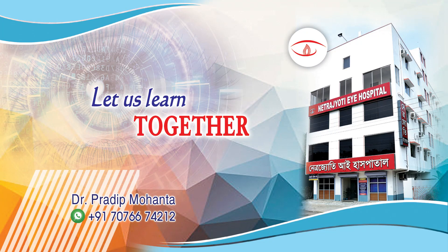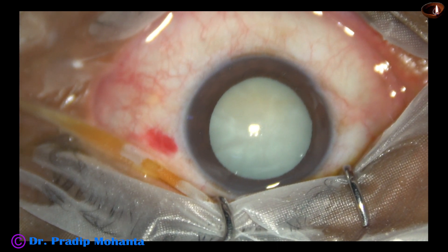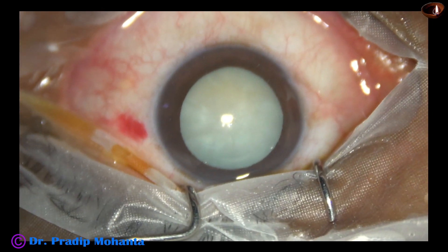Friends, welcome to my workplace for hands-on FECO and SICS training. This is a hypermature Morgagnian cataract. Let us observe this surgery.